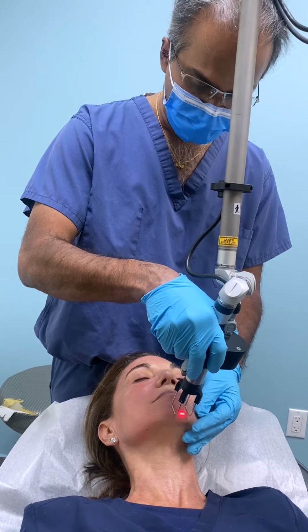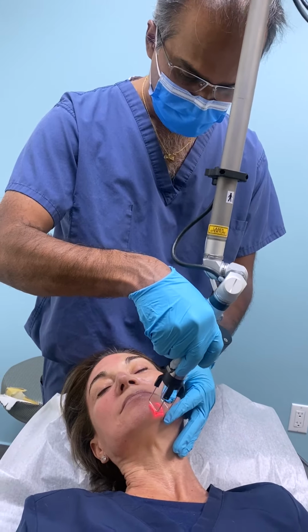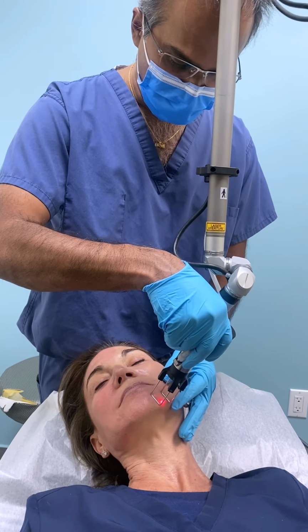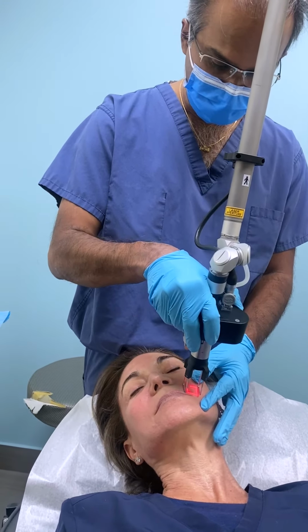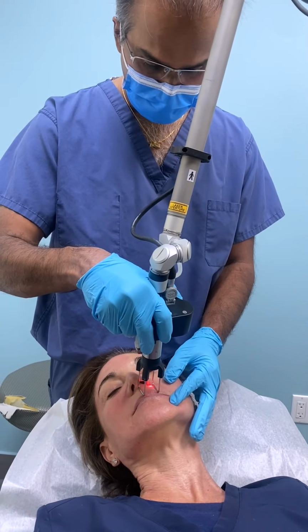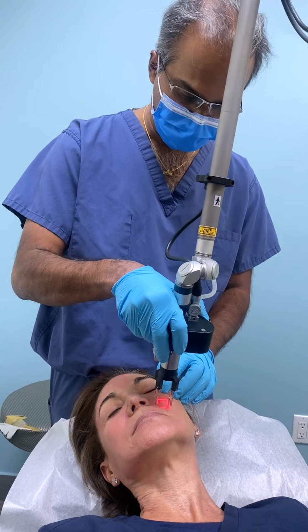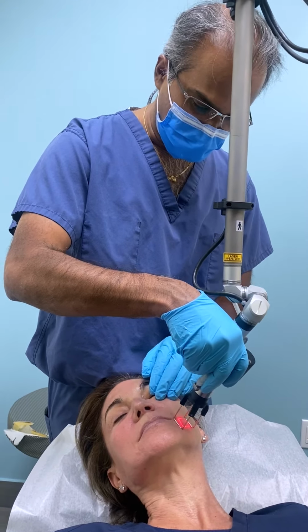However, with the improvement in the technology, we now have the ability to set the laser at various different settings, different degrees of intensity and energy levels and all kinds of things that can modulate the aggressiveness of the treatment on the skin. So the downtime is different for different people based on what the patients need. And so a conversation with the patient always helps to understand the motivation, the pain tolerance, their lifestyle, whether they're able to have a few days off at home, or they have to get back to work the same day or the next day, and that's how we really determine how aggressive to be.